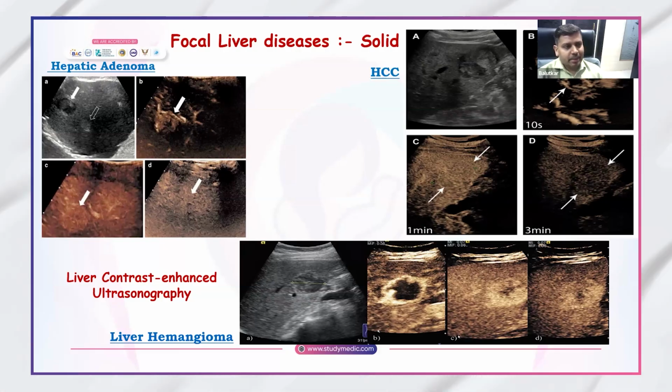Usually malignancies of the hepatic parenchyma present with a somewhat varied appearance. They are not that brightly echogenic. They are hypoechoic or heterogeneously hypoechoic, and at times they can be somewhat echogenic. So again, contrast enhanced ultrasound examination can help us to differentiate between various pathologies, benign and malignant solid liver lesions. Though it is not commonly done because CT and MRI have better spatial resolution, we can differentiate better on CT and MRI, but contrast enhanced ultrasound is also equally good.